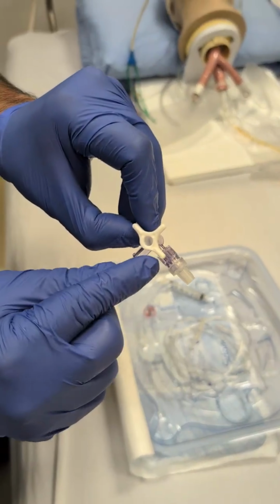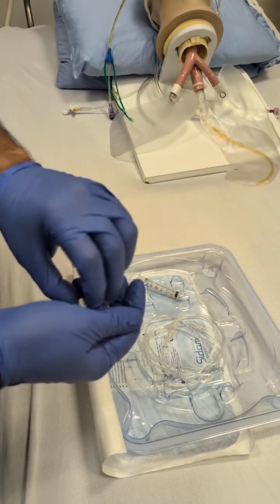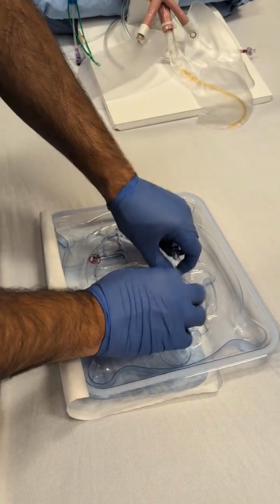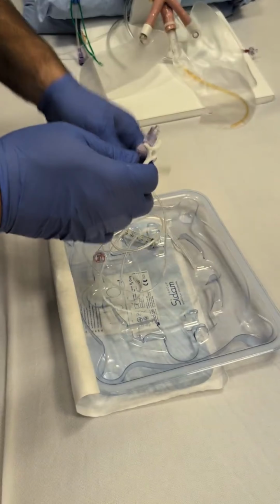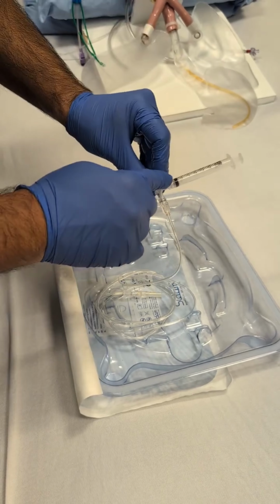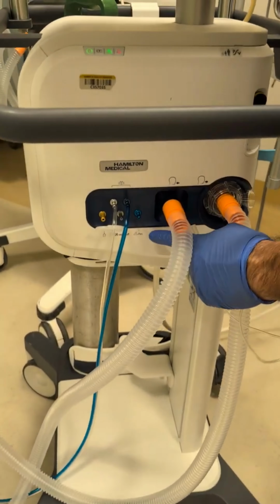Assemble the pieces, attach a 10 ml syringe to the top port, and attach the setup to the PES port of the C6 ventilator. Notice the stopcock is different than normal stopcocks. The arrow indicates which sides are open. In this example, Pete has changed the stopcock to be open to everything: the vent, the syringe, and the balloon.